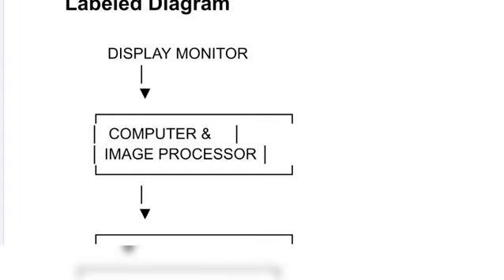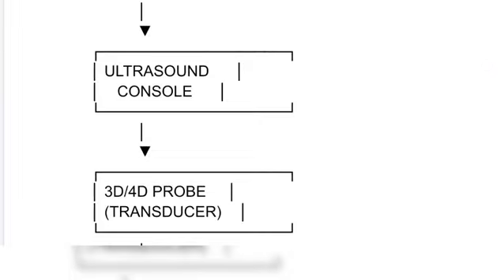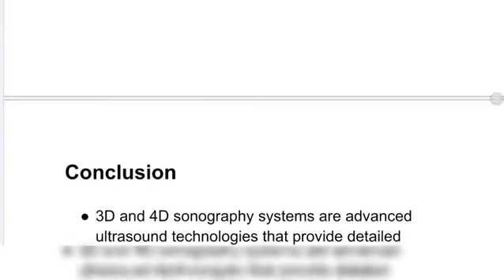And next is the labeled diagram. This displays the proper system. First is the display monitor, next the computer image processor, next the ultrasound console, then the 3D or 4D probe, that is the transducer, and next the patient.